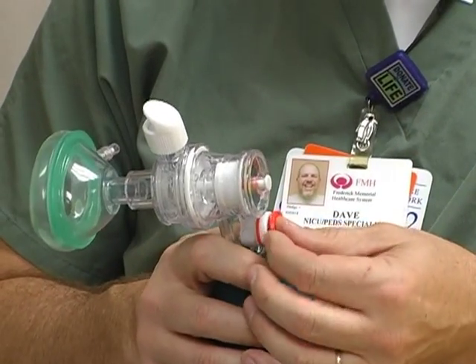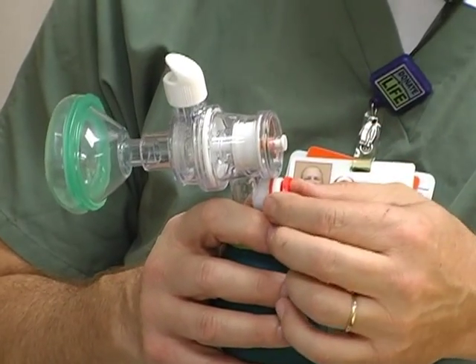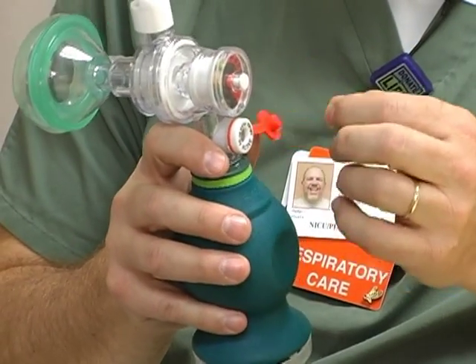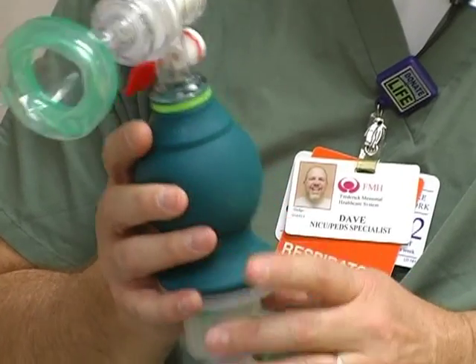There may be an instance where you need to cover it for a few moments — maybe for the first breath when you're first resuscitating the baby. But for the most part, you're never going to need to cover it. I want that orange flap hanging free and open at all times. So that's number one.